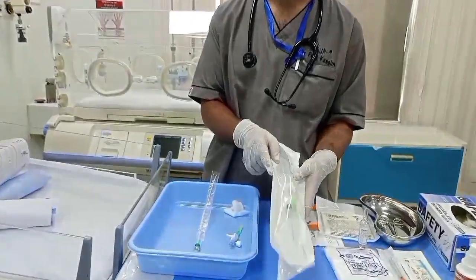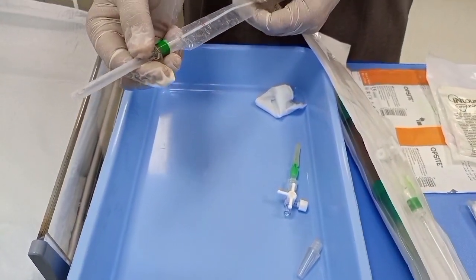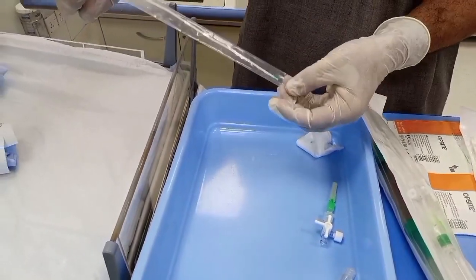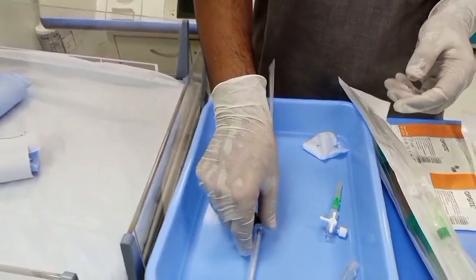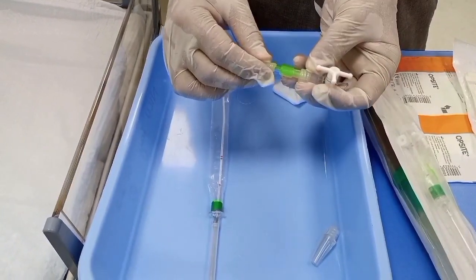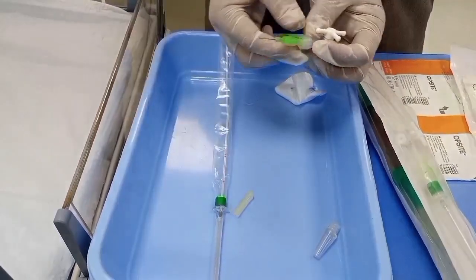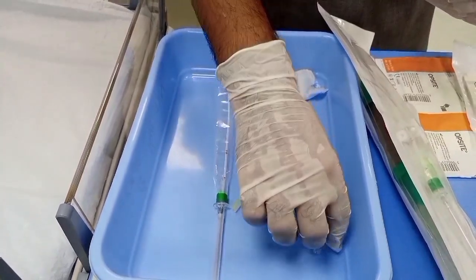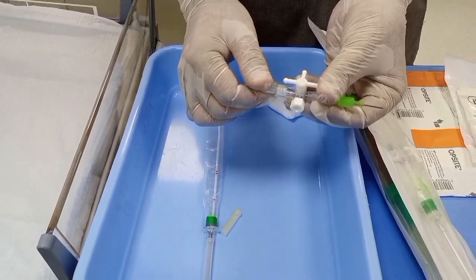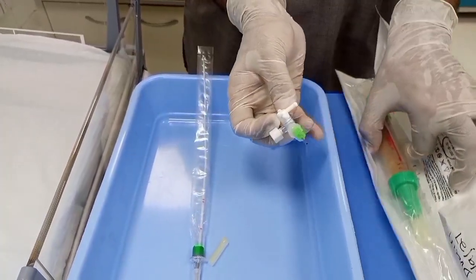After opening the packaging of the Easy Drain, you will find the needle holder covered with a cap, and the catheter inside covered with a barrel-shaped plastic sheath. The connection gadgets include a three-way connector and a needle connector. Remove the plastic cap, then take the conical connector and attach it to the other side — this will be the part to which you attach the Heimlich valve.